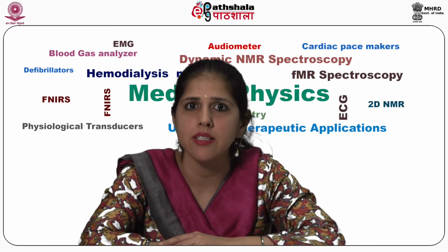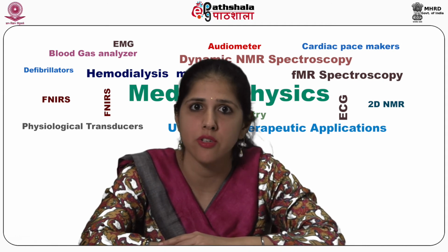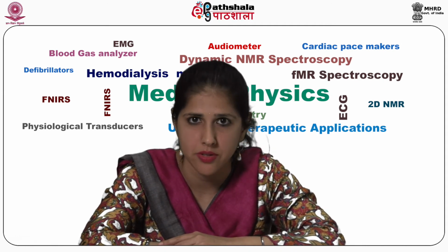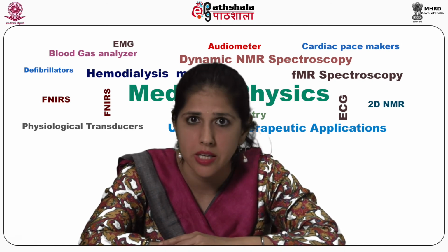The second thing is that in collective delivery systems, the problem is if there is a source of infection or there is an air leak, all these complications will be affecting all the patients who are being delivered by that particular system, which is not the case for a delivery system taking care of a single patient.